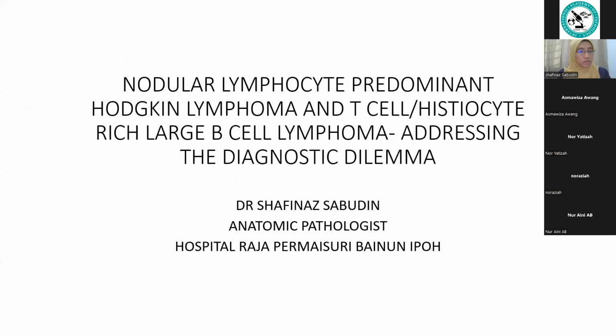Nodular lymphocyte predominant Hodgkin lymphoma and T-cell histiocyte-rich large B-cell lymphoma are two distinct entities. However, it is important to recognize that nodular lymphocyte predominant Hodgkin lymphoma has some variant patterns, and the variant patterns are the ones that have overlapping features with T-cell histiocyte-rich large B-cell lymphoma. These give some confusion and also diagnostic dilemma for us, the pathologists, when we are dealing with our tissue biopsies.